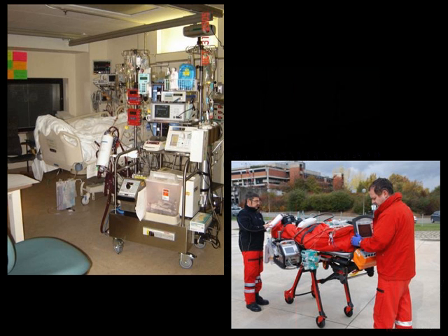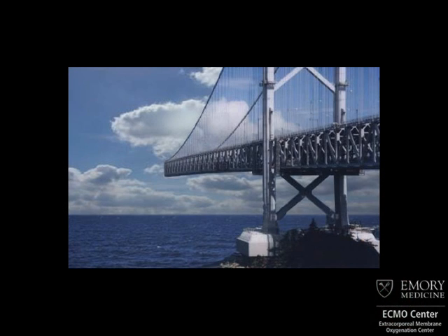The biggest problem with ECMO was that we had technical things to overcome, and there are still technical challenges ahead of us, but this is the biggest challenge that we have, which is the bridge to nowhere, which inevitably, when we're using technologies like this, we get patients onto occasionally. And avoiding the bridge to nowhere is really key because it's difficult for everyone involved: the patient, the family, us as providers, and the health system, because you can invest tremendous amounts of resources in patients and they end up succumbing to their illness. And this can take months for them to succumb.